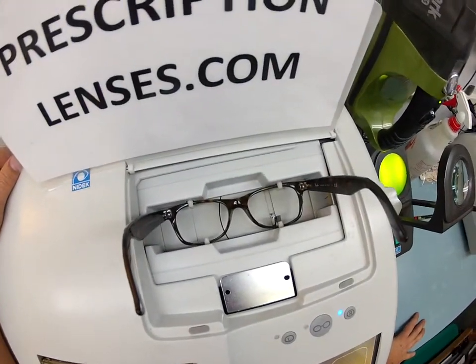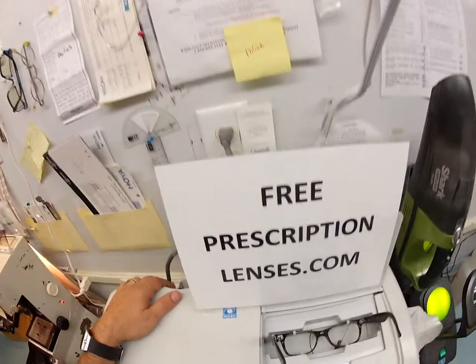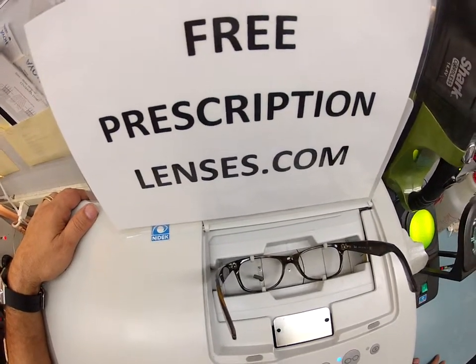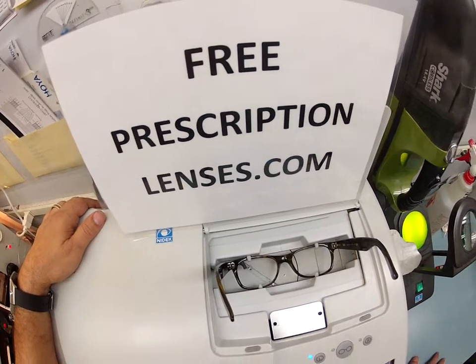The stylus is going to come up and trace the shape of your right lens, and it's going to move over and trace the shape of your left. Here at FreePrescriptionLenses.com, where everyone loves a bargain and no one is disappointed with quality. Now it's tracing the left.